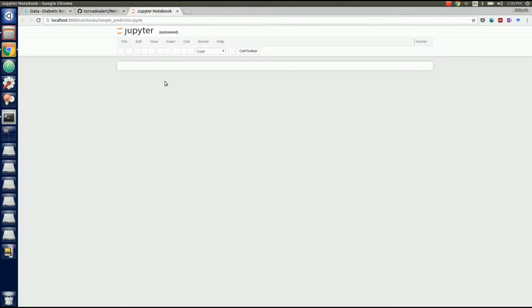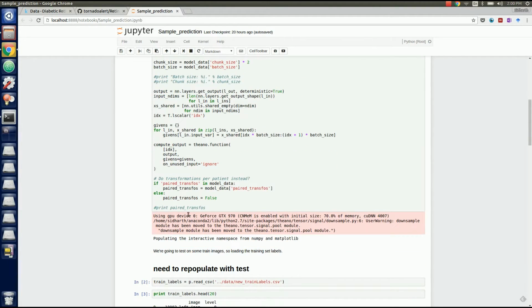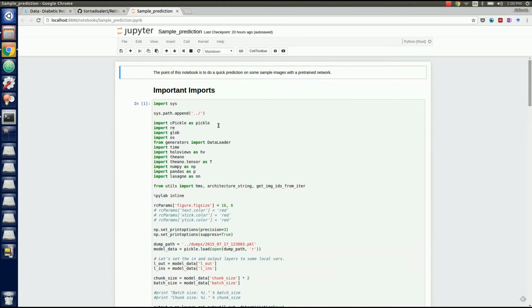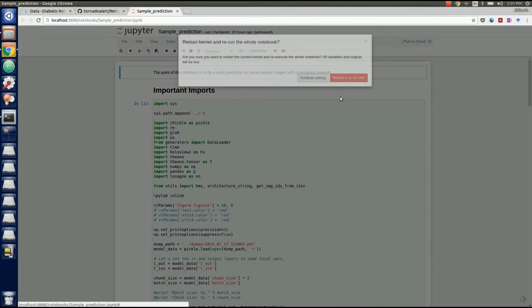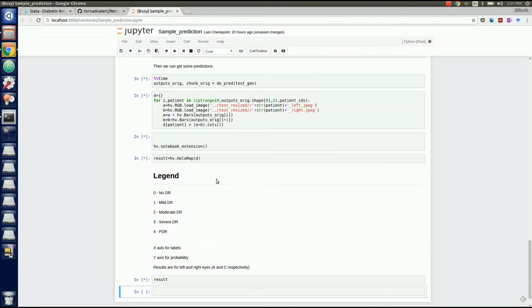So after it did that, it opens IPython notebook. So in this, you need to have a graphics card, and I'm running on Linux right now, and this is kind of designed for Linux. So you need to have Theano and CUDNN installed. Make sure you have CUDA and a graphics card, obviously. So after you open this notebook, just restart and run all. Now let's see what our network predicts.